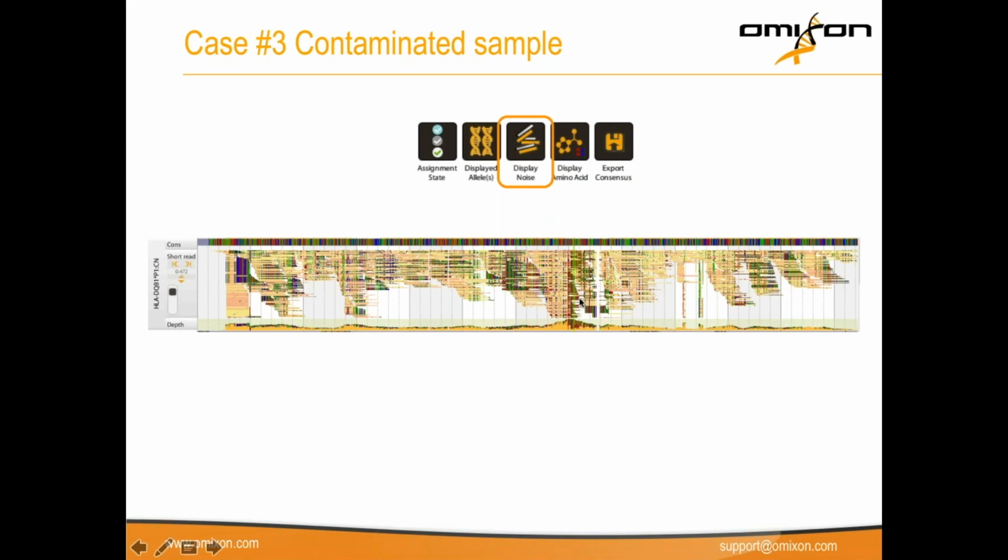So this concludes the demonstration of special cases and how the samples can be resolved using HLA Twin.